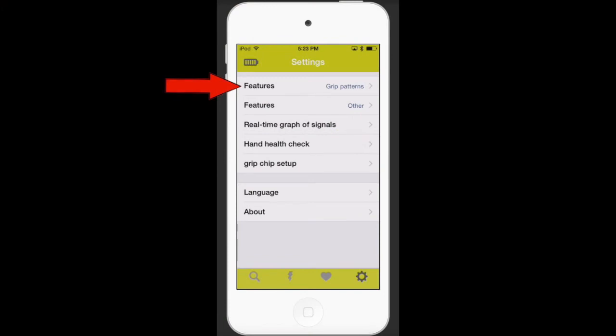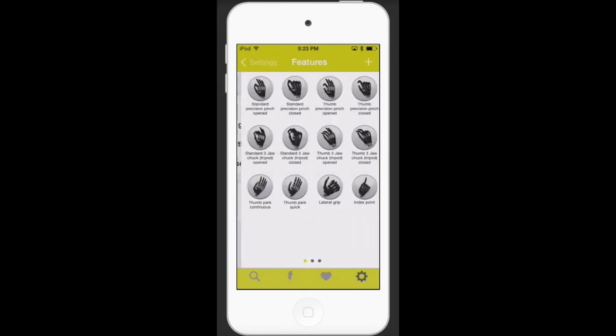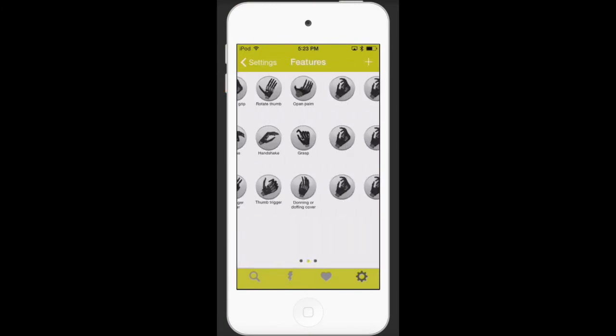Next, select the first option which is Features Grip Patterns, then swipe right to left until you see the page of MyGrips.